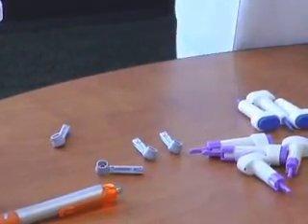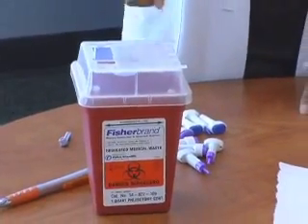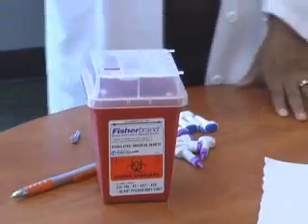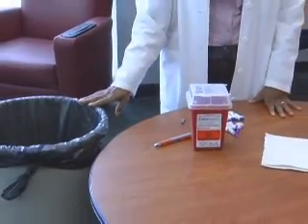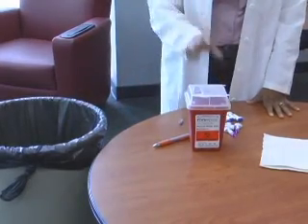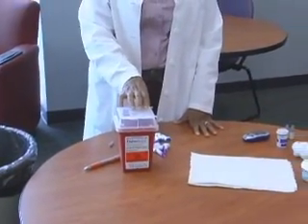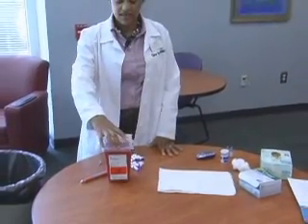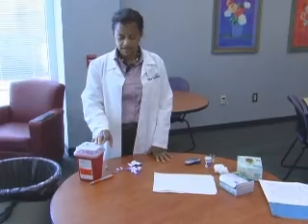I'll show you how to use these in a minute. Very importantly, you want a sharps container — this is where you should throw your used lancet devices. You also want a trash can nearby, because this is where you throw everything else: gloves, cotton balls, and test strips do not go in the sharps container. This trash is very expensive to dispose of, so we don't put things in there that aren't truly sharps.